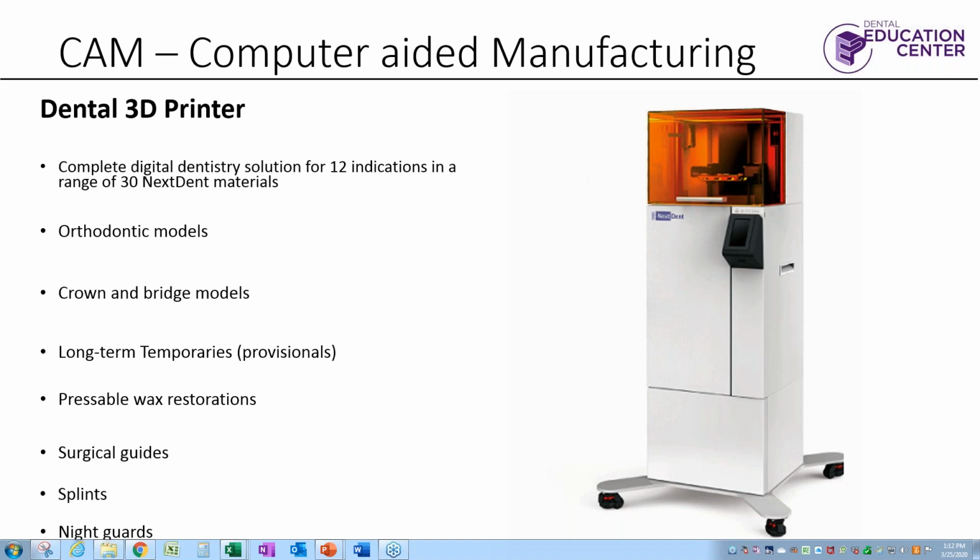There was a new material. A lot of these new long-term or permanent temporary materials are coming out, which are actually very exciting. You can take ceramic material and turn it into permanent restorations, which is really cool. I mean, you're still looking at 120 to 160 megapascals, but the permanent restorations are starting to show their ugly heads, and I think it's going to happen fast.